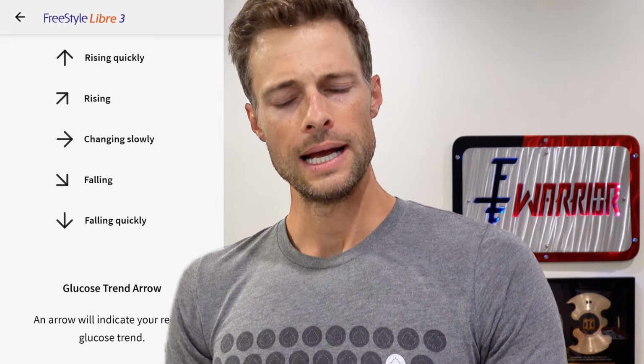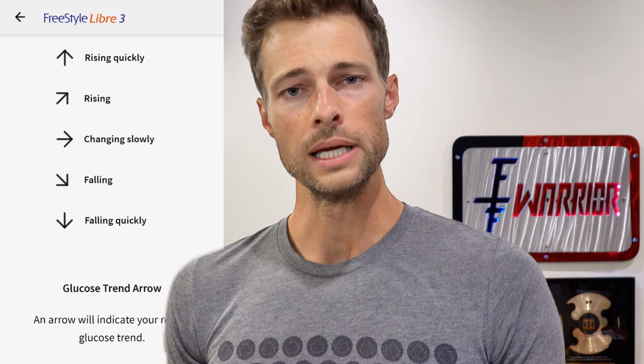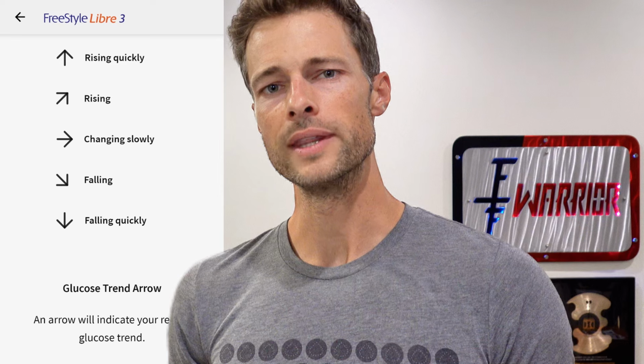We got the arrow charts, right? I'll put that on screen as well. And this shows the rate of change. So when you have a CGM, Dexcom does the same thing. It tells you how fast your blood sugars or blood glucose, I use those interchangeably, how fast they're moving, right? So if it's stable, you're stable. If it's slanted up or down, it's starting to move in that direction.